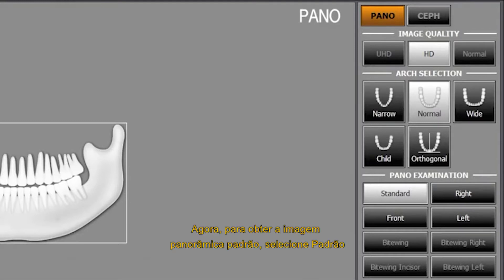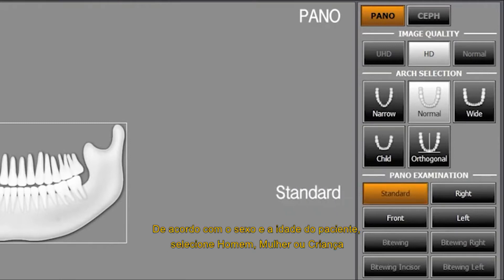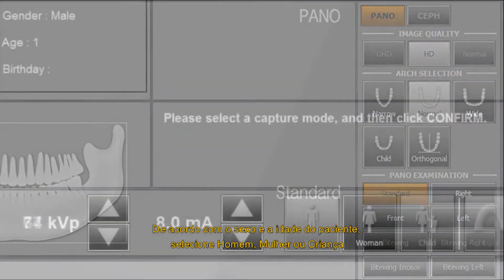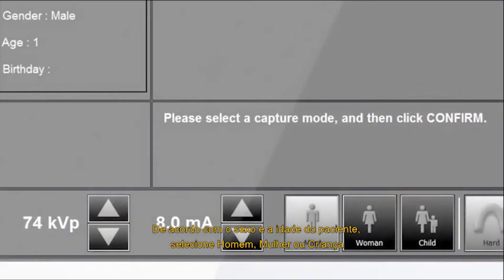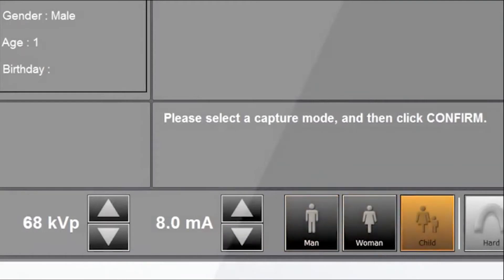For the panorama standard image capture, please select the standard. According to patient's gender and age, select man, woman or child.